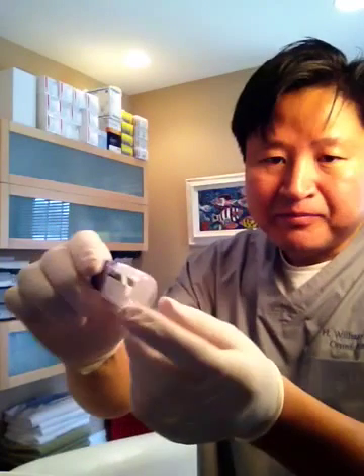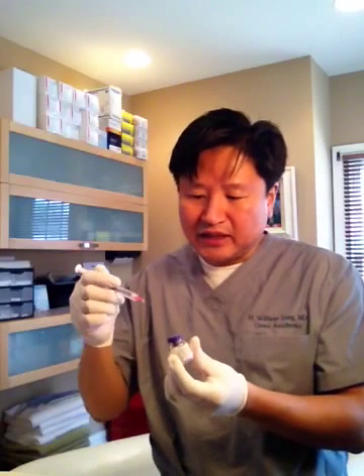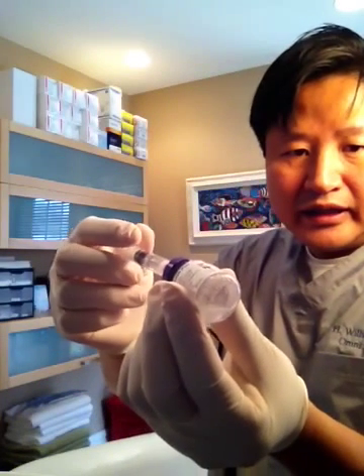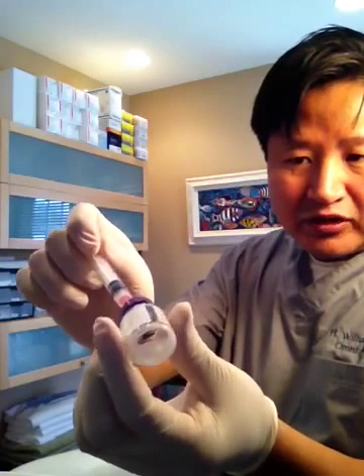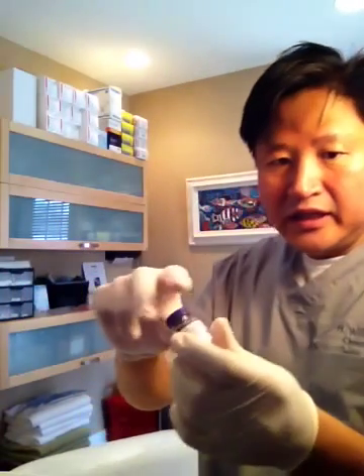What we have to do is dilute or reconstitute it with saline. The amount of saline you put in determines how concentrated it is. We put the fluid in, and as you can see, it's dissolving the product.